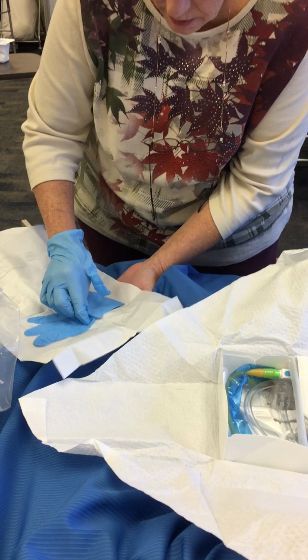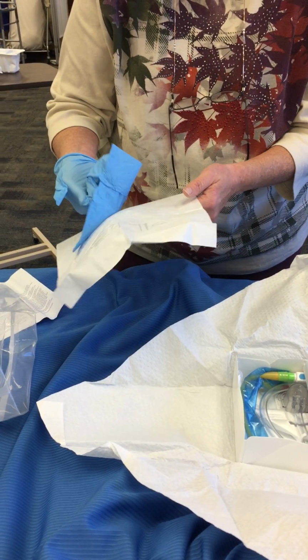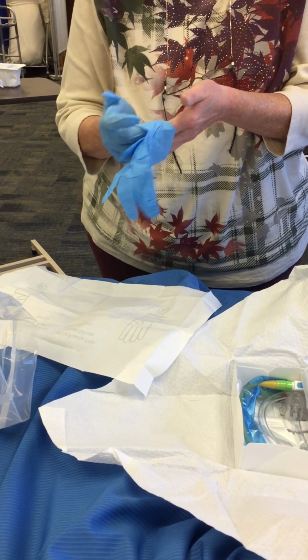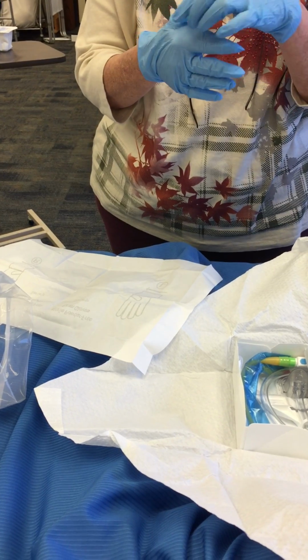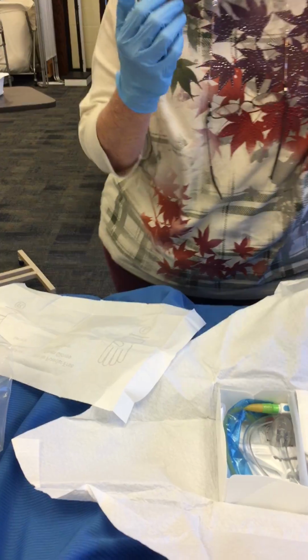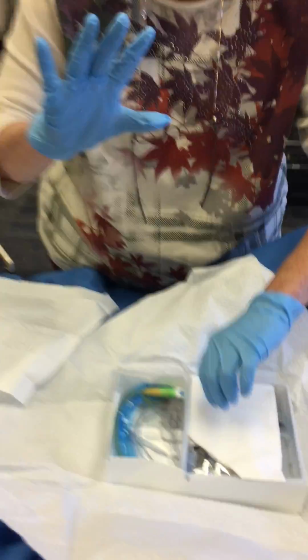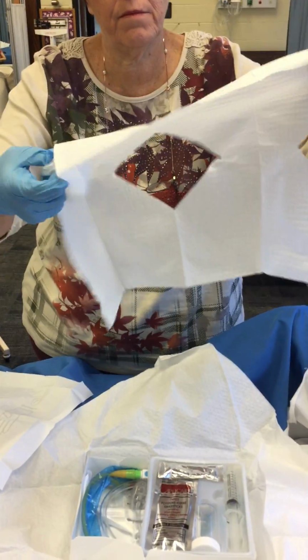And cuff the second one. There we go. Now my hands are sterile. I know this is a little bit lower than it needs to be, so apply your fenestrated drape.